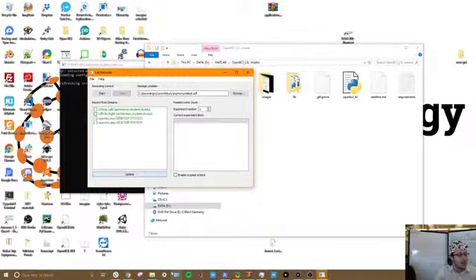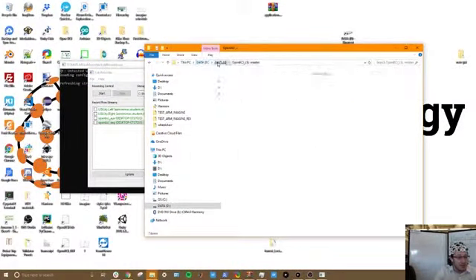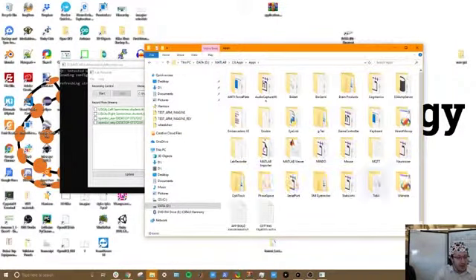So if I click update, voila, we have an OpenBCI stream. So there's the accelerometer and the EEG. Then the next thing that we're going to want to do is there's this wonderful little apps folder we have for LSL. And you can see we can collect a whole bunch of different types of information. You can collect from a Wiimote, of all things, or an eye tracker, or let's see what else we've got in here. We've got a mouse. We've got this MATLAB viewer application that lets you view the EEG. I'm actually going to show you that later.